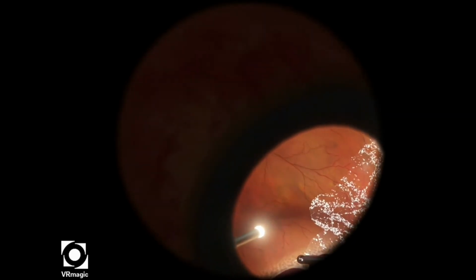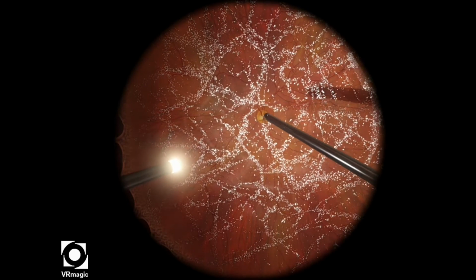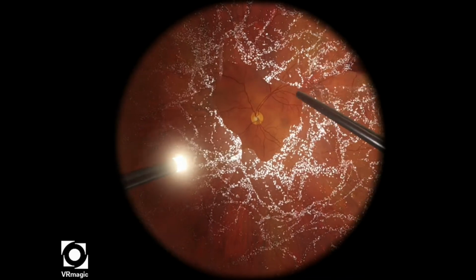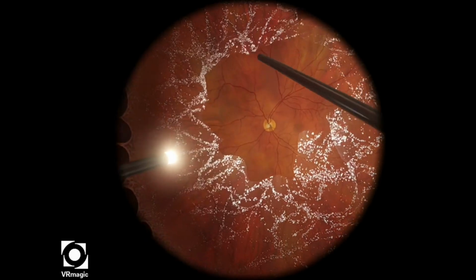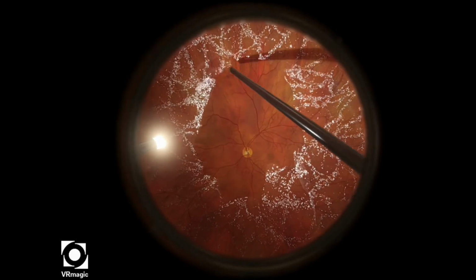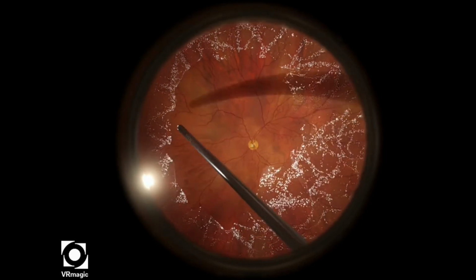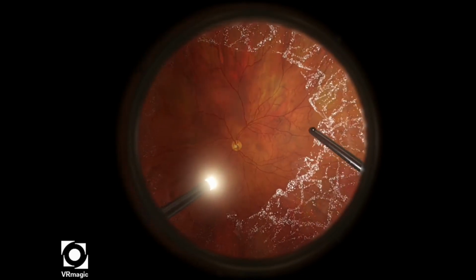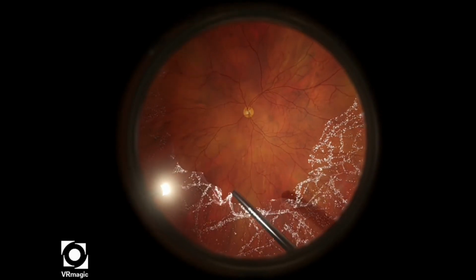You may not be able to get all of the peripheral vitreous, and I think that's really okay. The level doesn't really expect you to get as much of the peripheral vitreous as possible. So I stopped that attempt because I left enough of the vitreous remaining, and I'm showing you another attempt here where I'm able to quickly cut away the peripheral vitreous as best as I can. So I'm doing a very quick cut here. The video is sped up a little bit just for the sake of time.